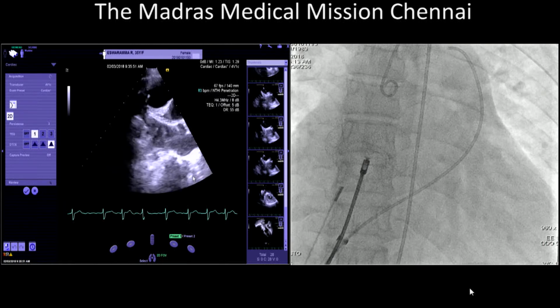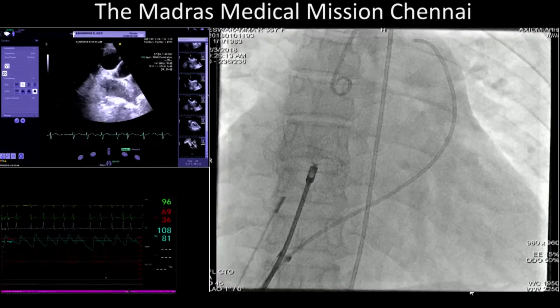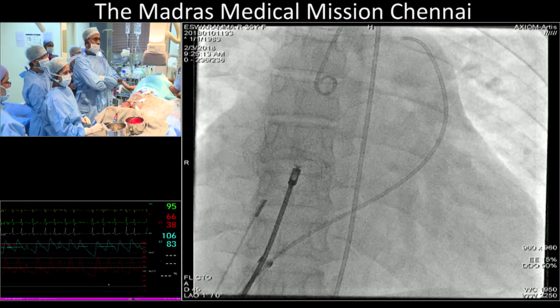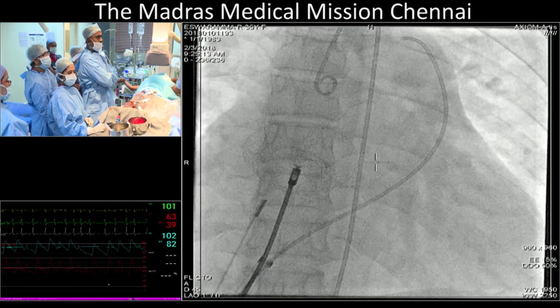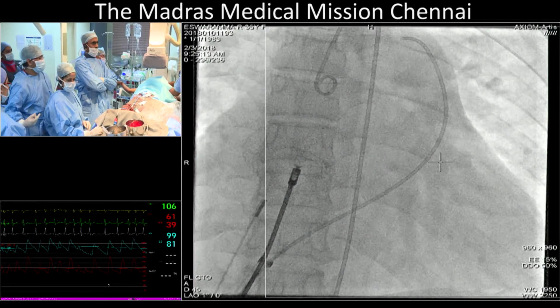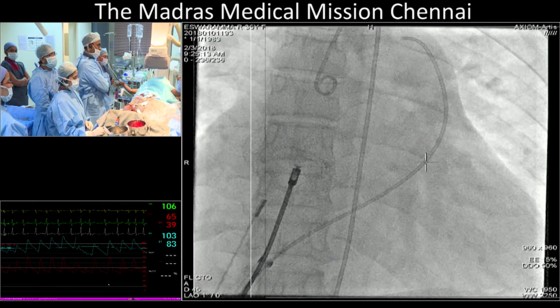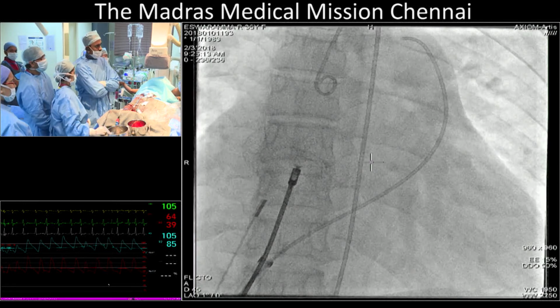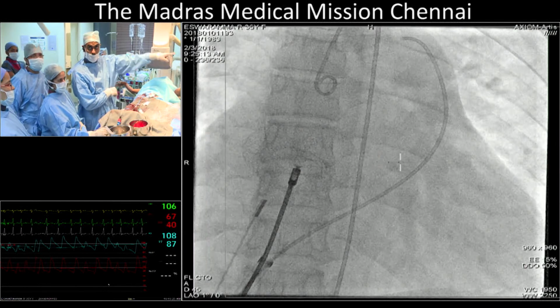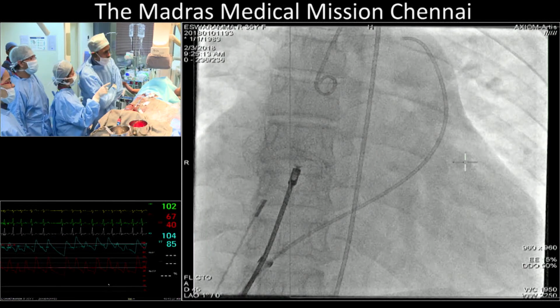Hemodynamics live. So one of the reasons, initially in 2004 when we did the first fenestration with Amplatzer, remember the fenestration has to go through the right disc, the waist, and the left disc, right? So by the time you put the device in, the alignment is not good. So in fact, we had echo. Thanks to the hemodynamics.